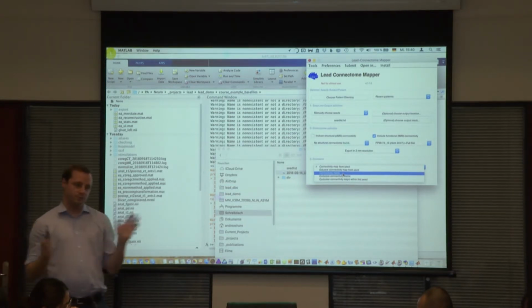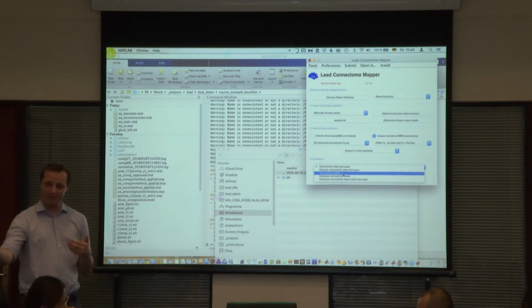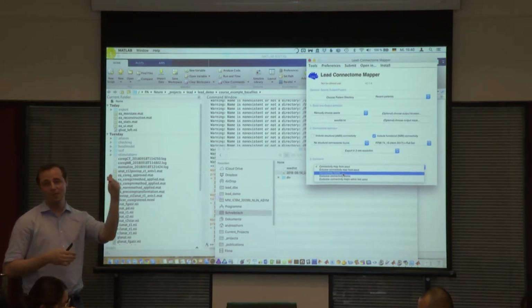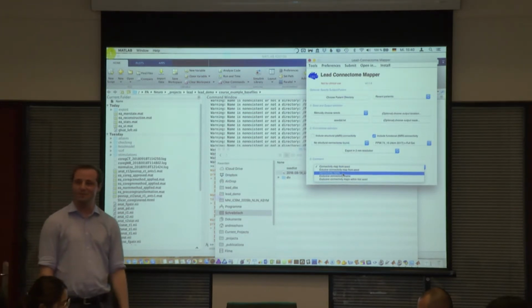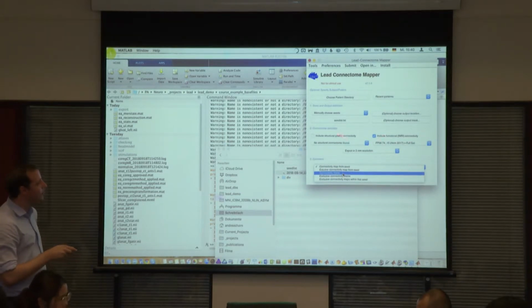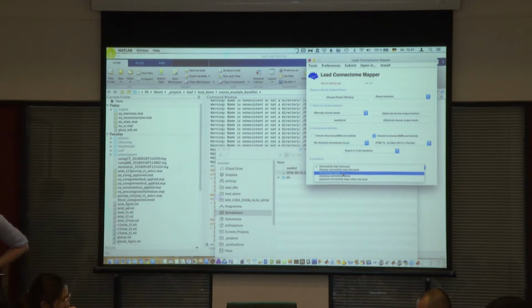So what you could do, just as an idea, is take an SMA seed and 20 patients' VTAs, and then calculate the matrix and you get a 21 by 21 matrix. Then you can use only the entries between the VTAs and the SMA and correlate that with UPDRS. That's one other popular choice, and you can do the same for fMRI, but also for structural connectivity.